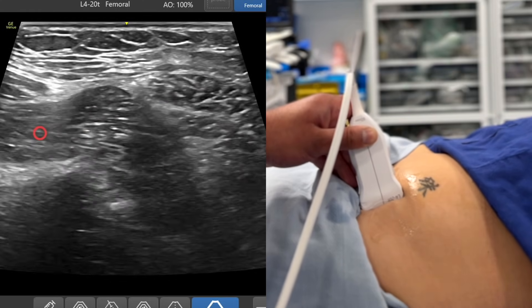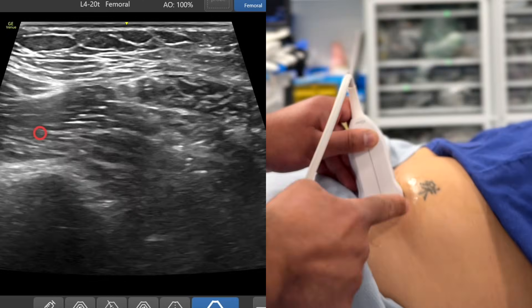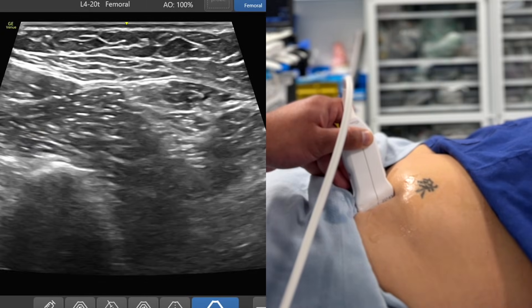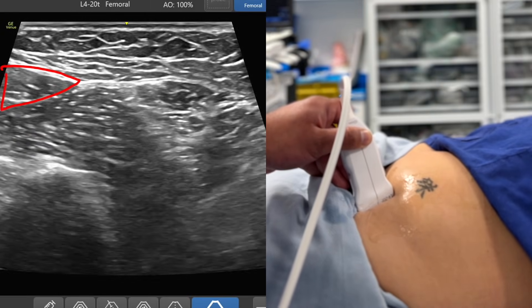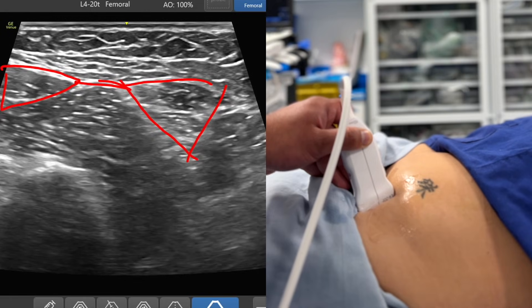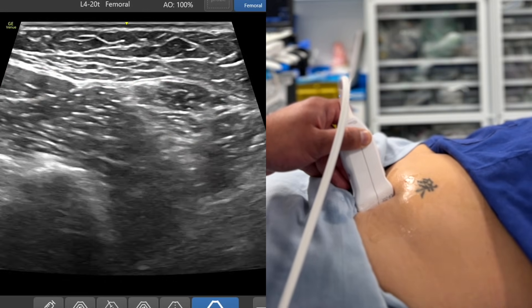Having slid directly off the anterior superior iliac spine, I'm just going to expose where the belly button is right over there. I'm going to direct the cephalad part of the probe ever so slightly towards the belly button. And now I've got a nice view on the screen — we've got the classic bow tie appearance. This is the sartorius, this is the middle part of the iliacus muscle, and here is the internal oblique.